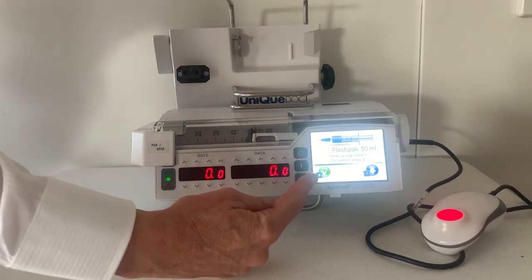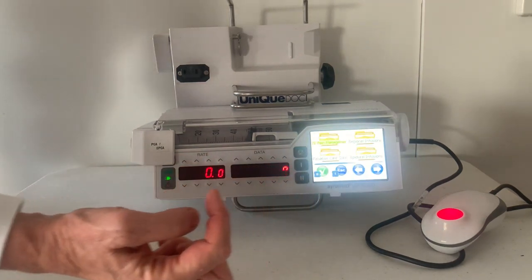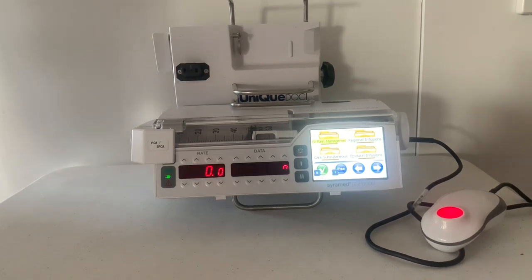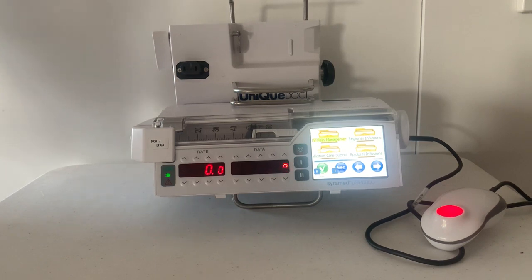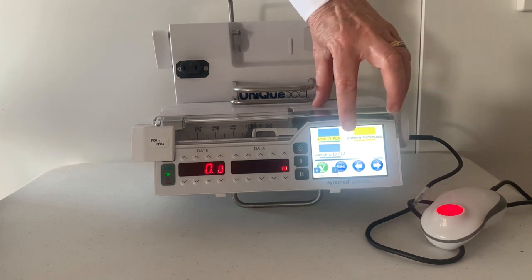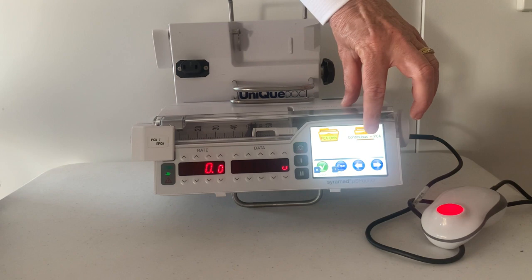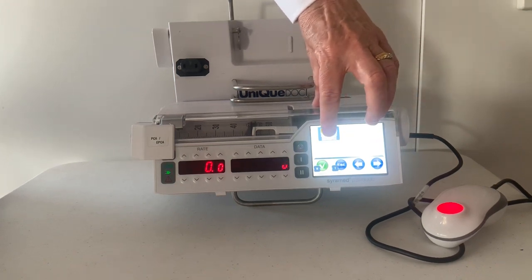The pump is now asking me to confirm the type of syringe — tick to confirm. The folders and icons are configured according to hospital requirements. Choose the folder that matches your prescription. I'm going to choose IV pain management, then adult IV PCA, continuous plus PCA, and morphine one milligram per mil.